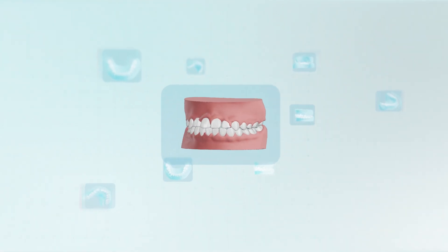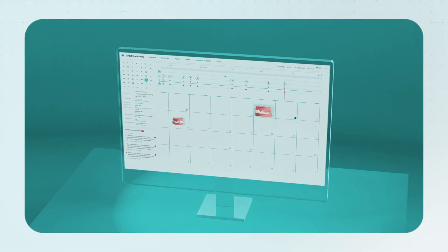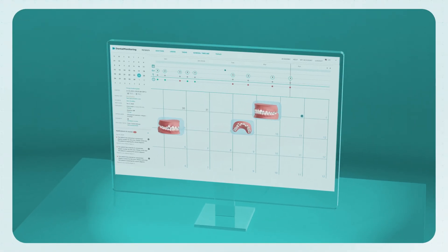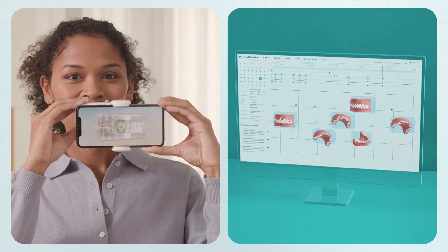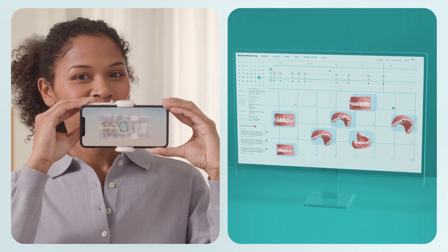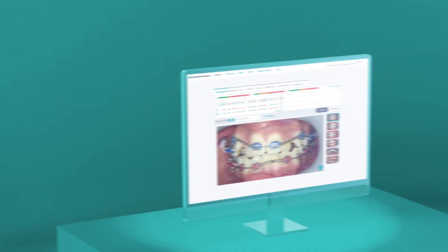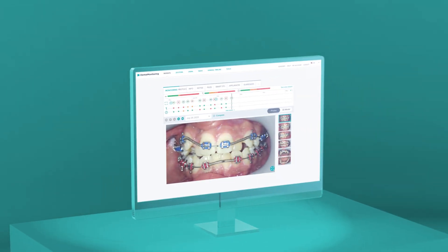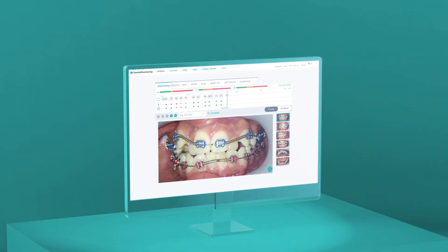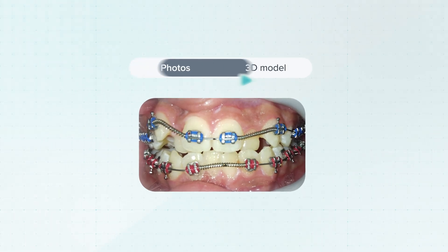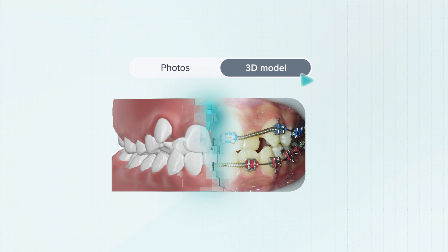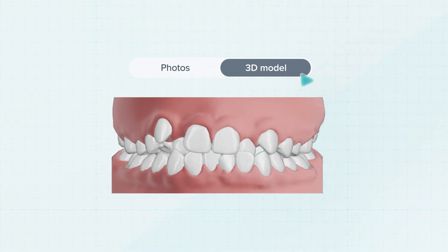Imagine obtaining new intraoral scans of your patients every week, all without any in-person visits. Thanks to our unique technology, you can now convert intraoral photos into precise 3D models.